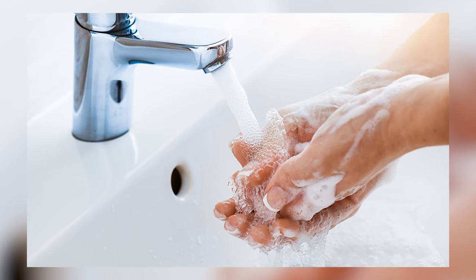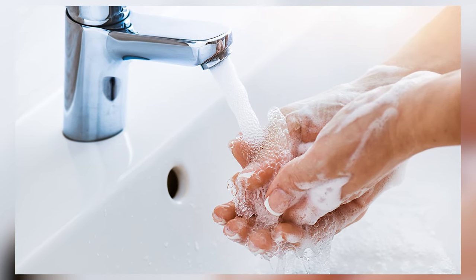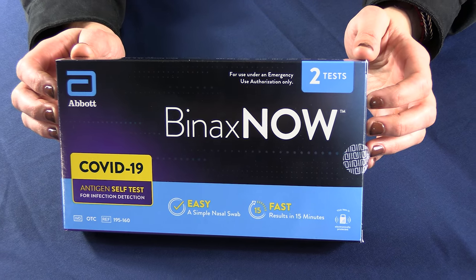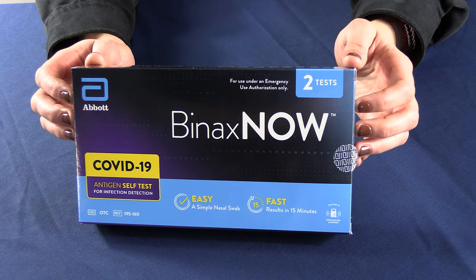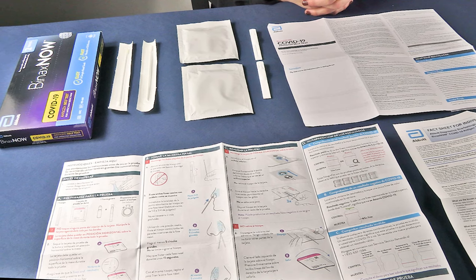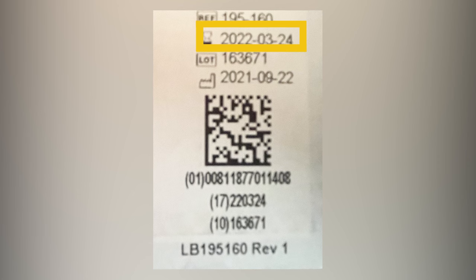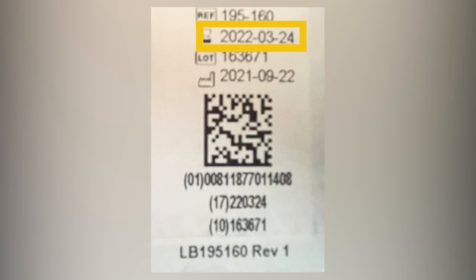Before you test yourself, disinfect the testing area and wash or sanitize your hands. Make sure your hands are dry before starting. Test kits vary by brand, so check the instructions in your kit first. Be sure to check the kit expiration date. Do not use a test kit if it is expired.